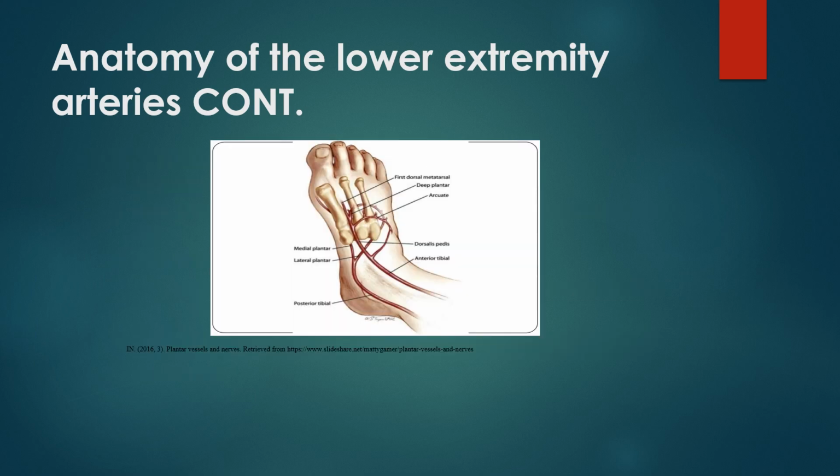And here I have an image. If you look at it, you can see your posterior tibial artery. As you follow the posterior tibial artery down, you see your lateral and your medial plantar artery. So you see your medial right here and your lateral plantar artery.